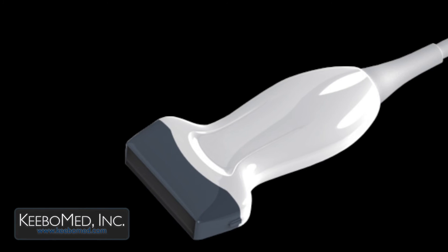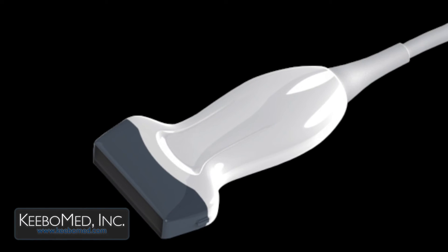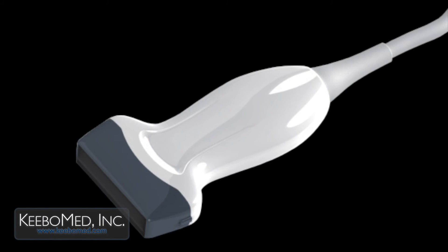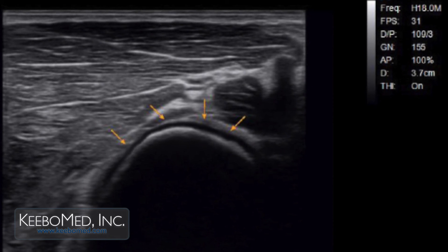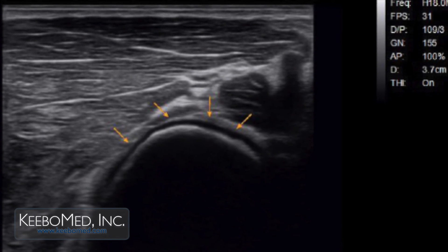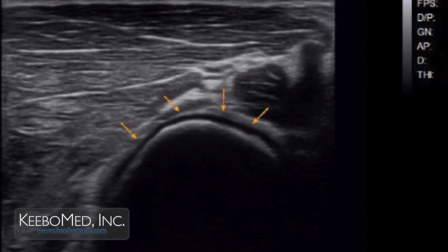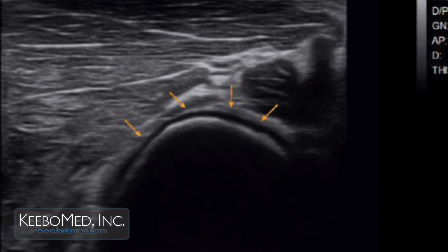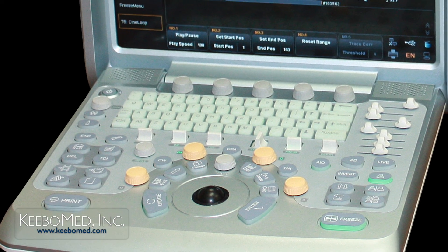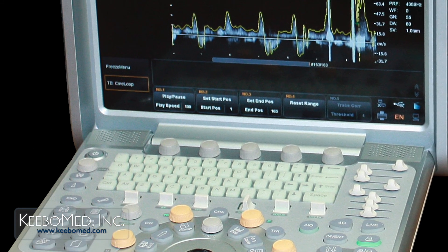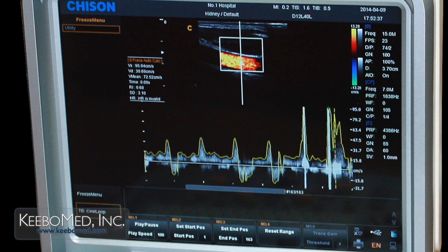The Q9 also features a unique linear probe with a high frequency of up to 18 megahertz that will produce detailed imaging at a superior resolution. These advanced functions make the Q9 unlike any other ultrasound available today.